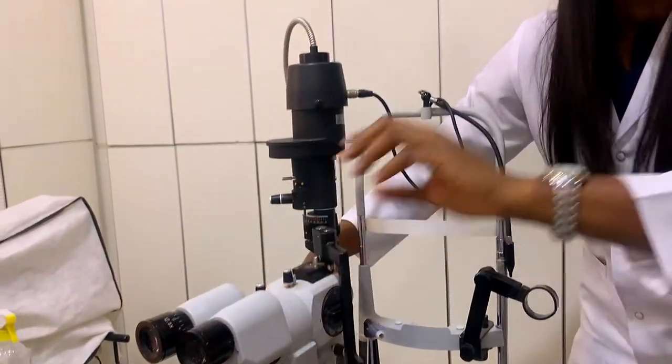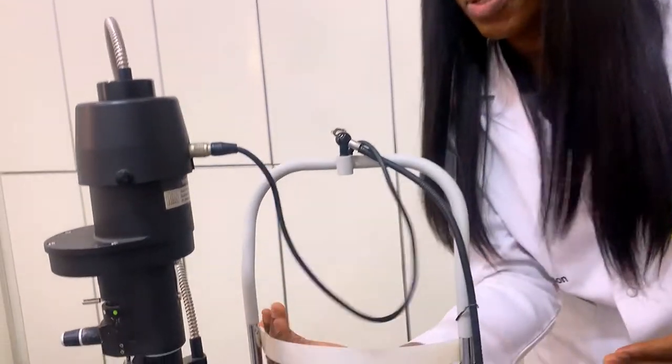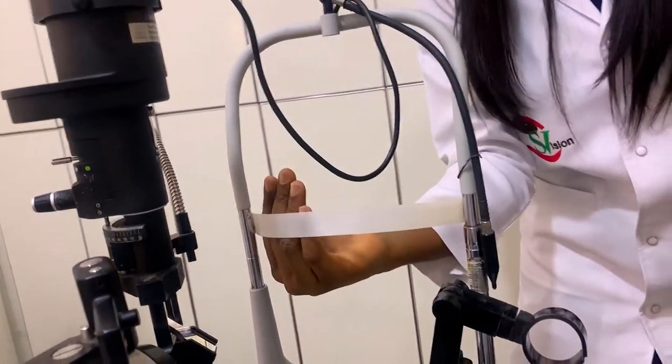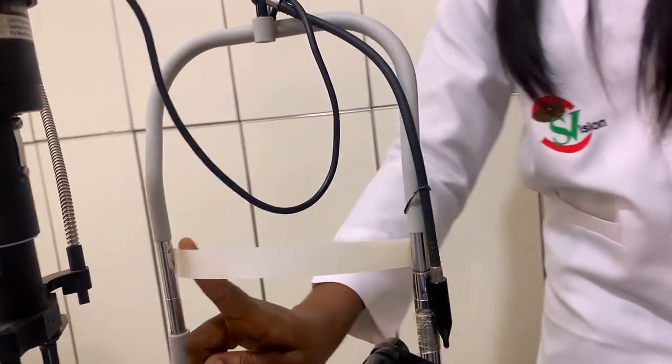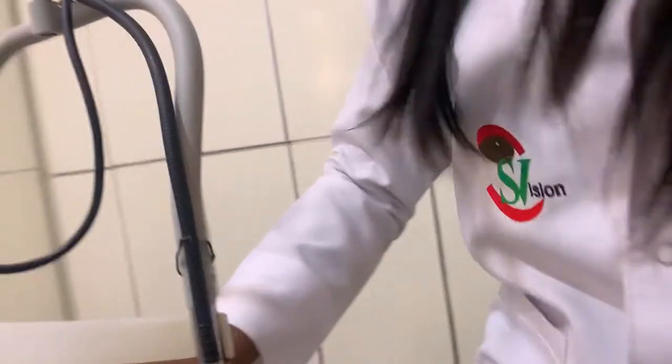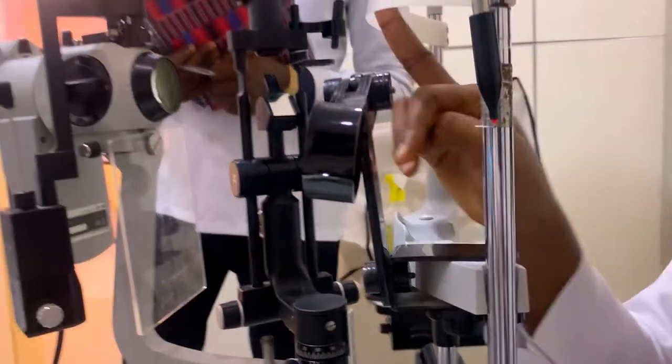The mechanical system. Remember, whatever you don't see me move here, it's not the mechanical system or the engineering support. First on the mechanical system is what is called the forehead rest. This is the forehead rest. Please come and see the forehead rest. When the patient rests their forehead during the slit lamp procedure, they have to rest their forehead like this.